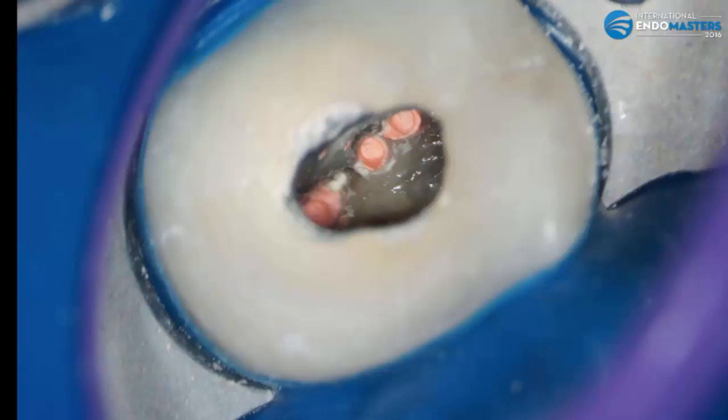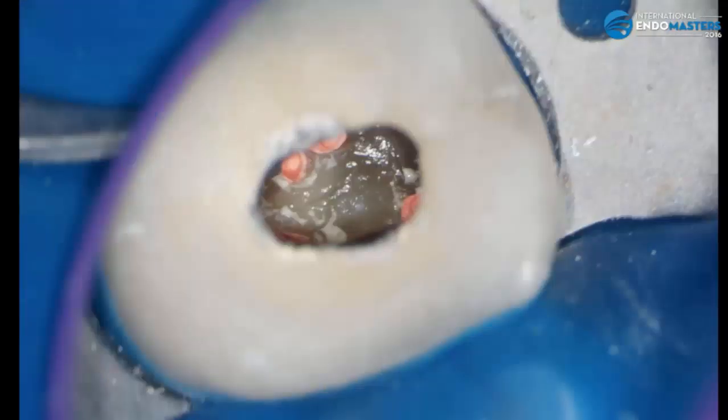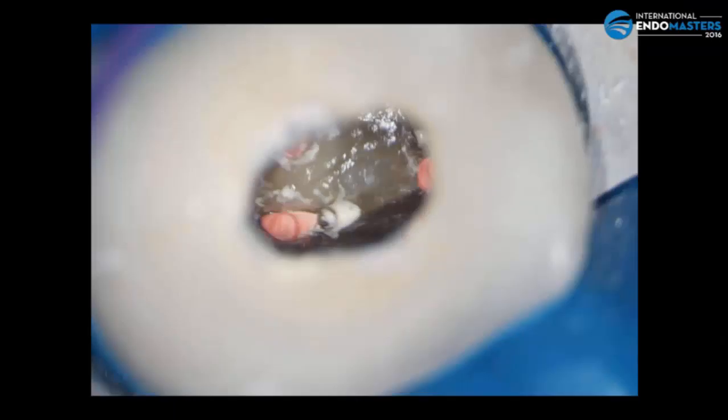In this other view, we can see one mesiobuccal, and here we can see the palatal and the MB2. My first impression was that the instrument was not very good. To me, it seemed very fragile due to the extreme deformation of the file.